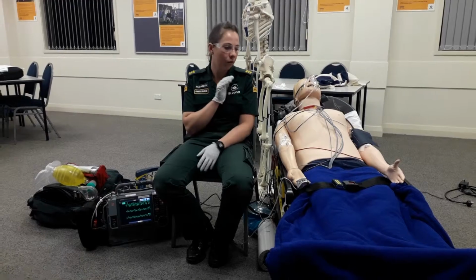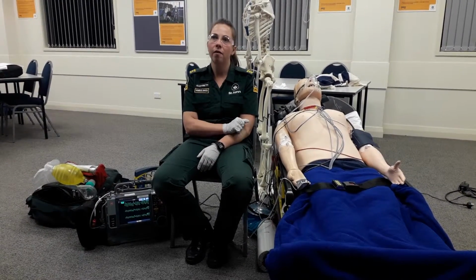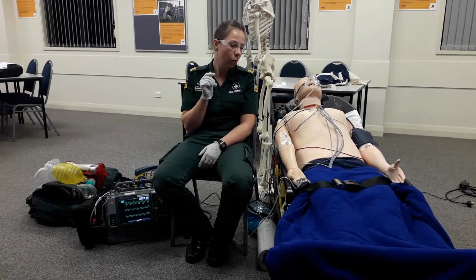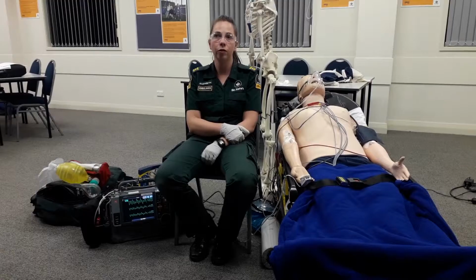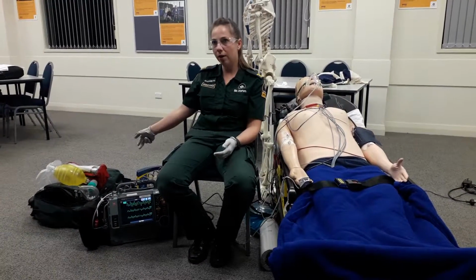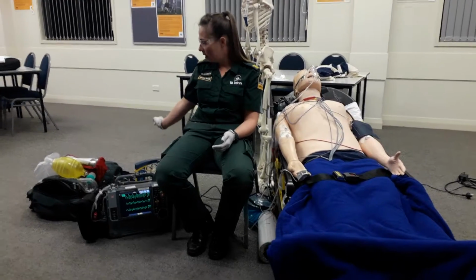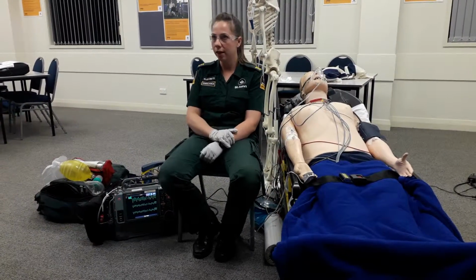Treatment so far, we've positioned the patient supine on our bed. We have administered oxygen. We've gained bilateral IV access, wide bore, and we have fluids running. We are also preparing for resuscitation with our bag valve mask, our airway adjuncts, suction, and we have placed pads on his chest.